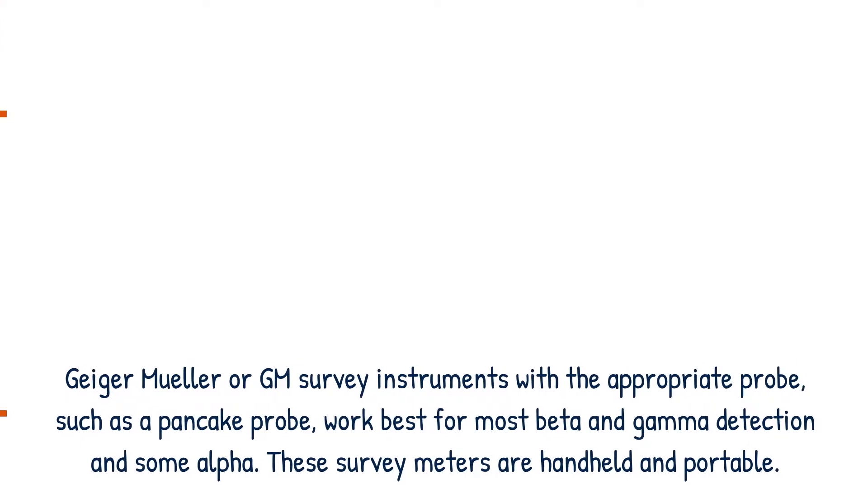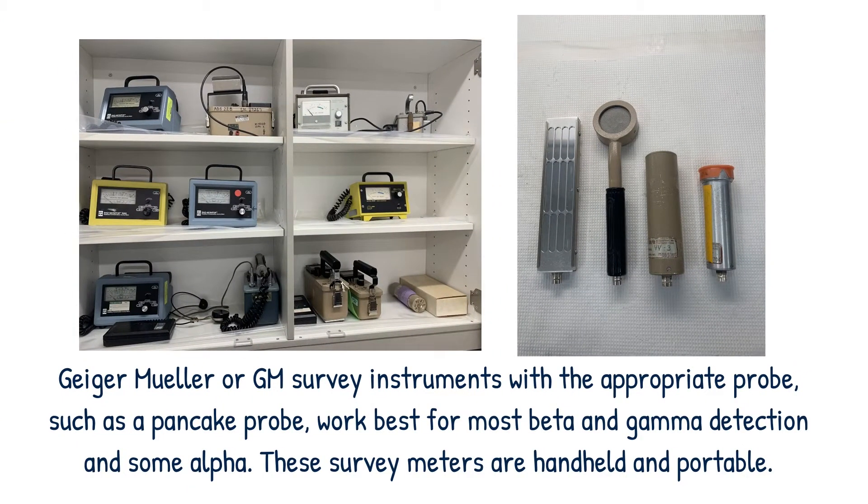Geiger-Mueller or GM survey instruments with the appropriate probe, such as a pancake probe, work best for most beta and gamma detection and some alpha.